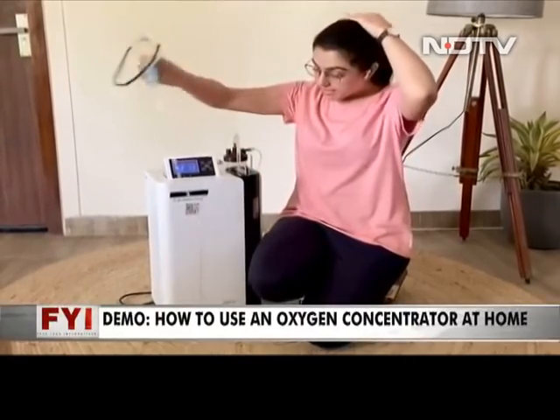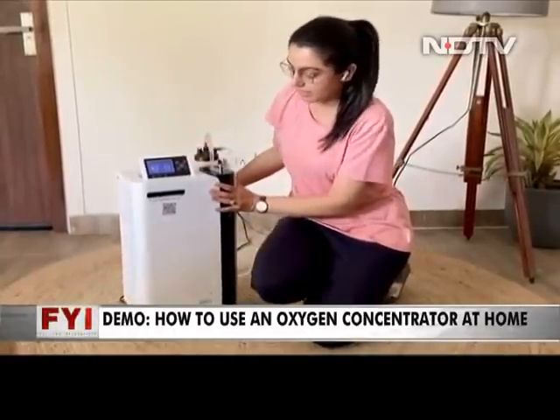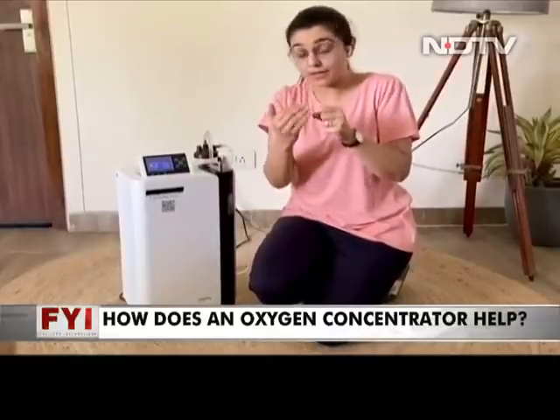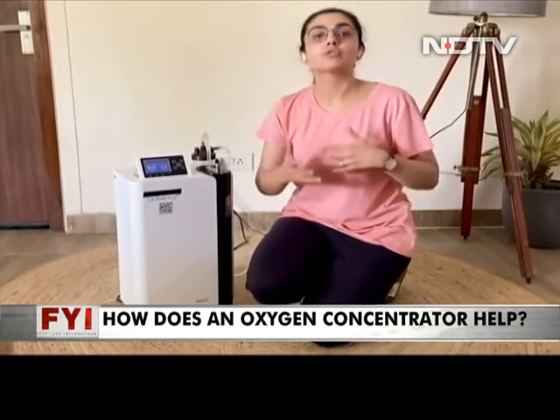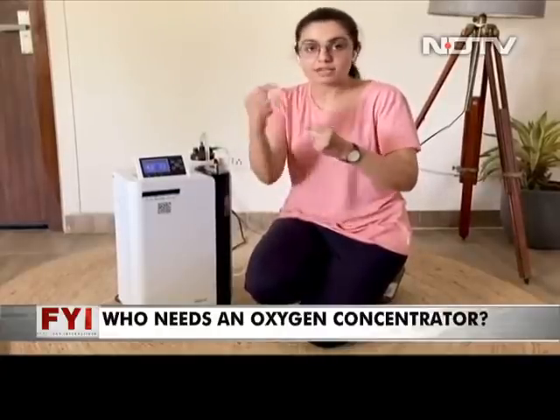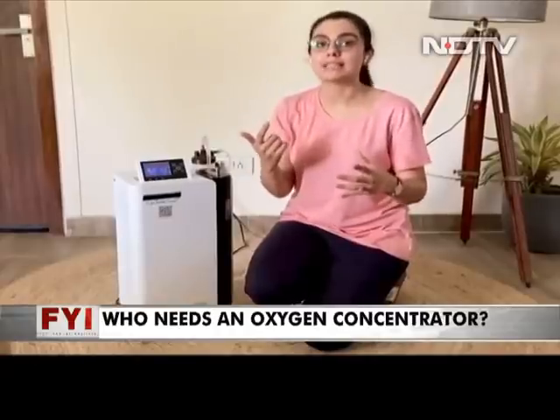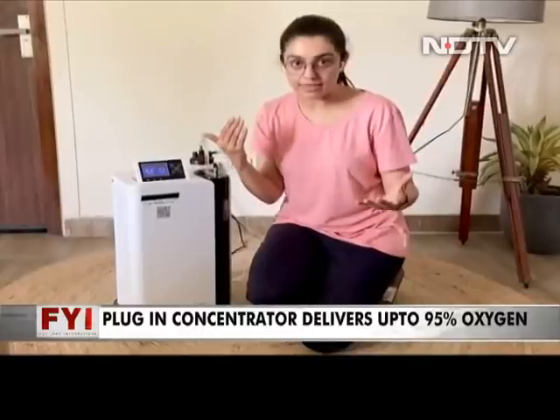Now, why am I saying this is important? Because let's understand the mechanism really of an oxygen concentrator. This machine essentially is drawing in oxygen already present in the air, squeezing it literally, purifying it further, humidifying it, and then giving it to you. So on an average, a room like this would have about 21% of oxygen. This machine sucks it in, purifies it, concentrates it, it goes to the humidifier and you have it. So the thing to remember is that if you're using this for long hours, ensure that your room is nicely ventilated. There's constant flow of air. So your doors and windows need to be opened now and then.